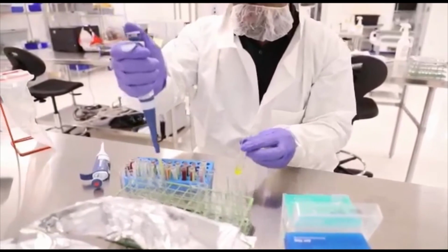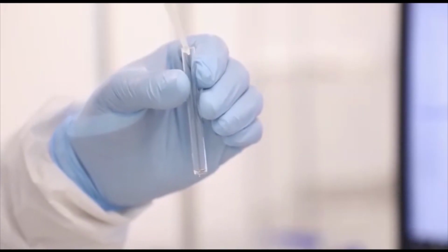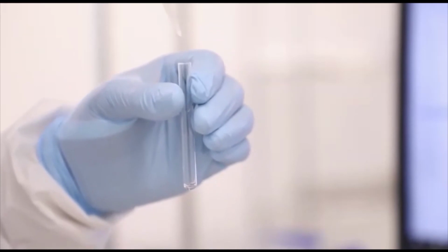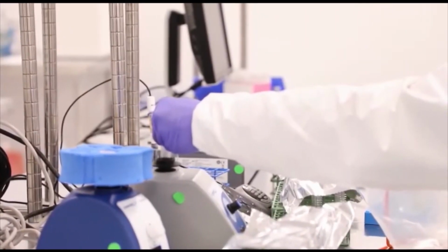So first of all, to clarify, an endotoxin test is not a sterility test. I often get that question from our customers when they're performing a sterility test, and I have to explain to them no. But we do perform that test in conjunction with the sterility test because it measures the level of pyrogens within the formulation. That's particularly important when you have an intrathecal formulation that's going into the patient's spine. It can cause severe damage if that level of pyrogen is not measured appropriately. That's why we perform an endotoxin test.